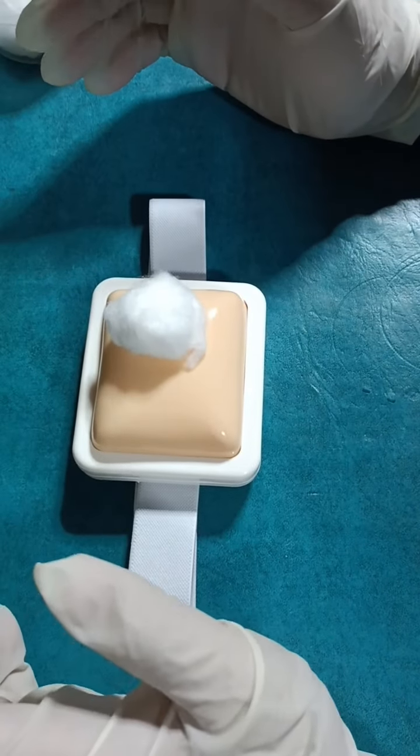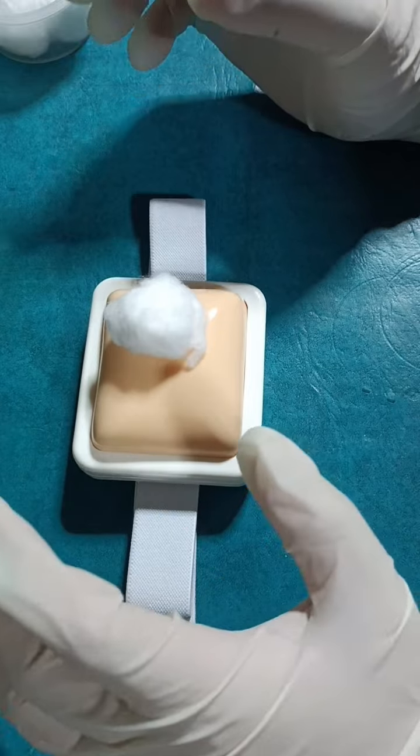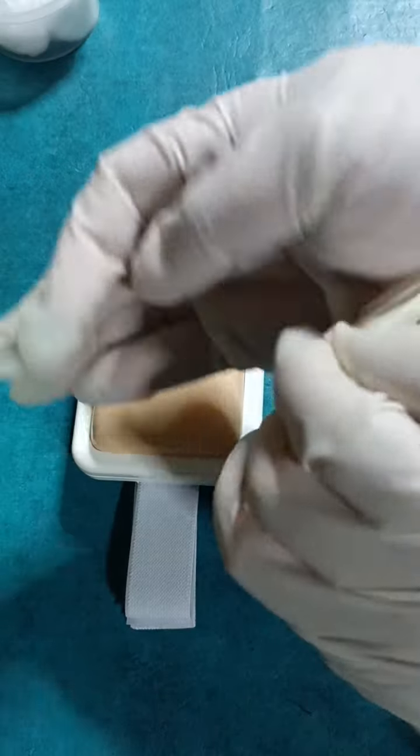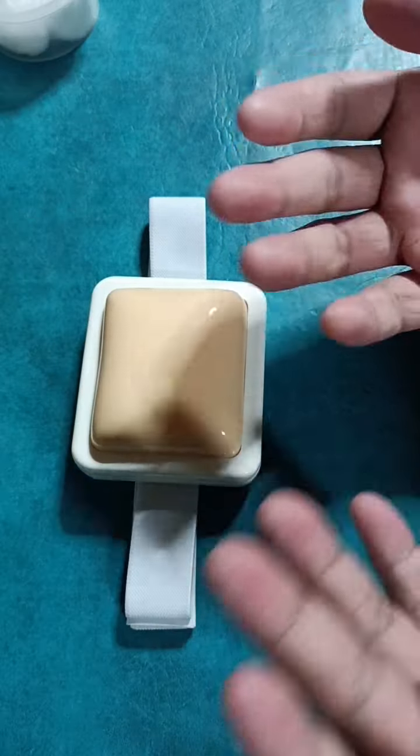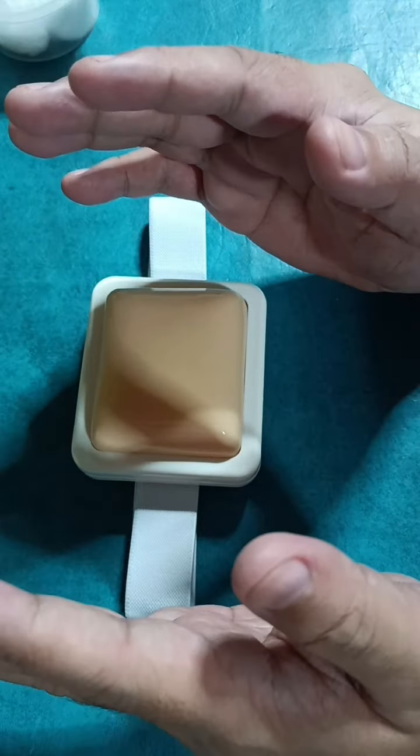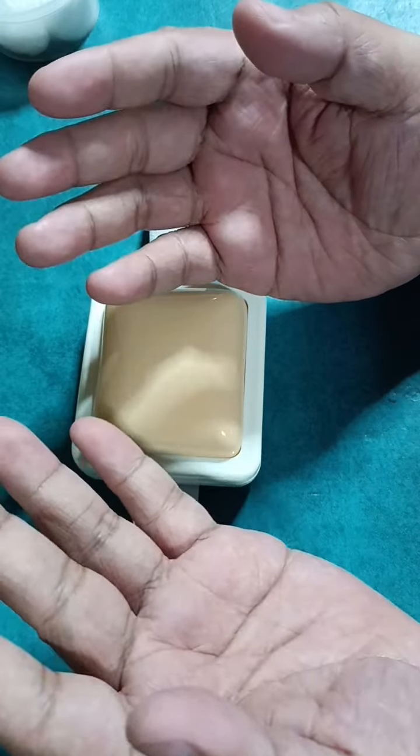After performing the subcutaneous injection, discard the gloves, and then do proper hand washing.